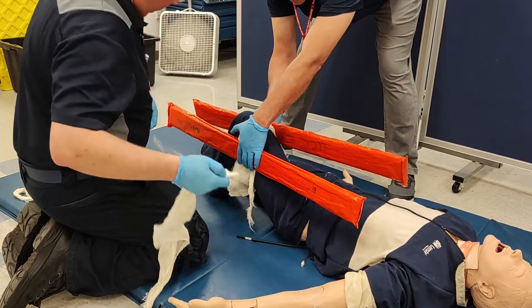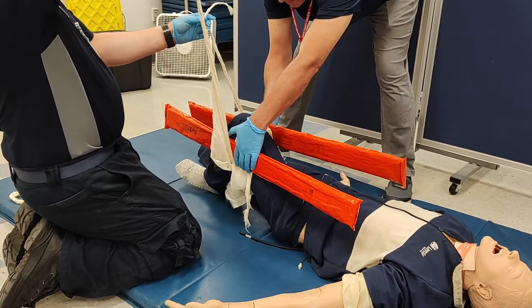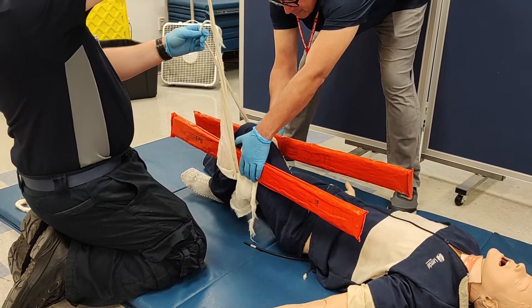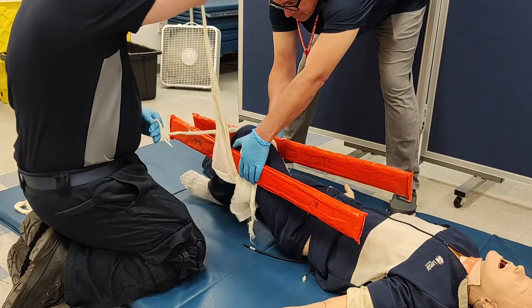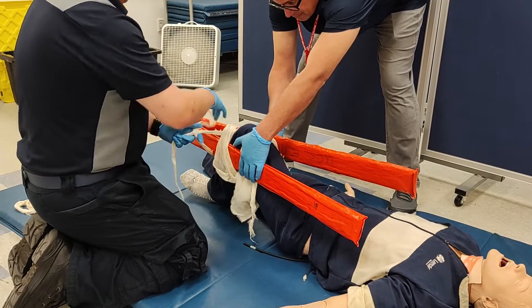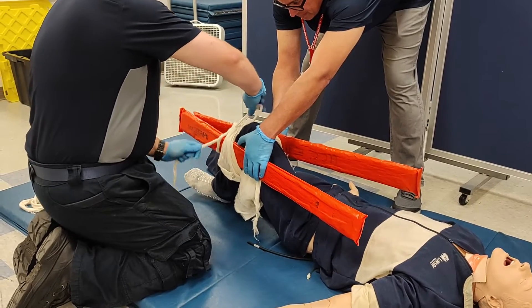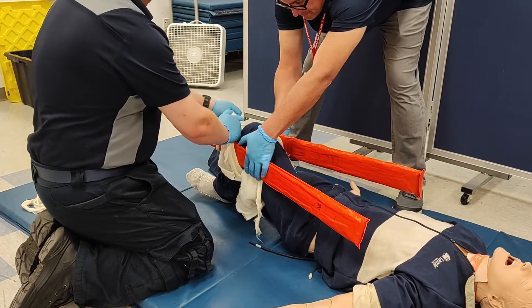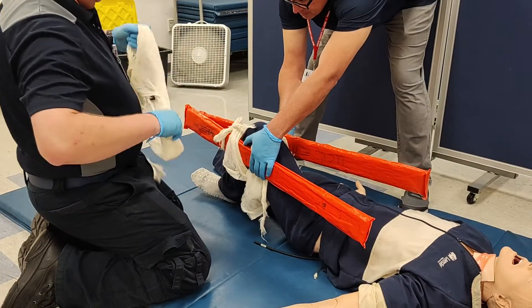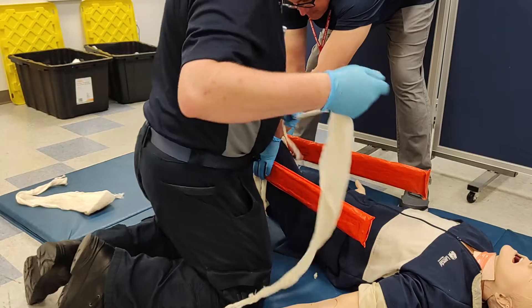EMT number one holds the splints in place while EMT number two applies cravats numbers two and three. Applying the cravat, he puts it underneath both the limb and the splints with two-thirds of the slack on one side and one-third on the other. The long end is passed around just the splints a second time to provide tension. It is tied with an overhand knot in loops, as this cravat will be revisited later for a second tightening.